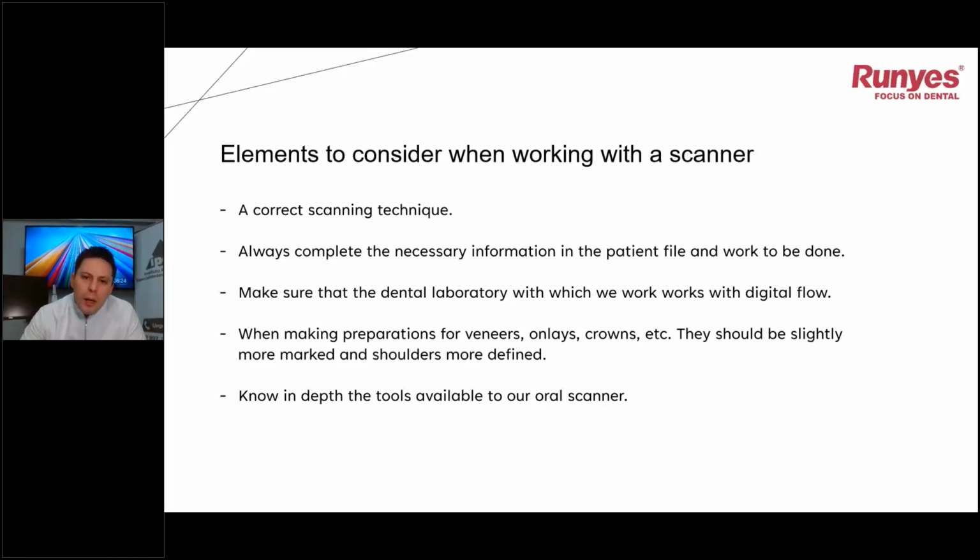A little tip also, when we are doing digital dentistry, it's always better that the preparations we do for veneers, for crowns, for onlays, are always a little bit more marked. The shoulders have to be more defined and well marked.